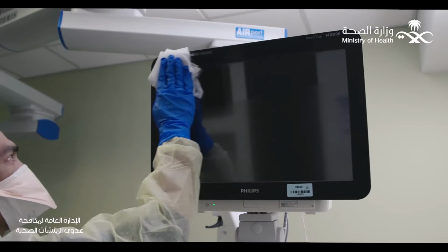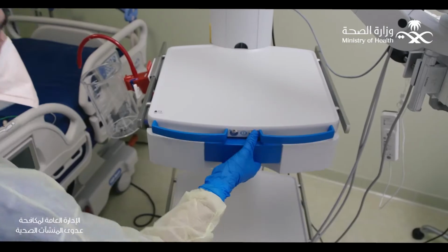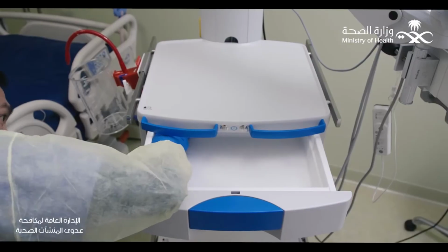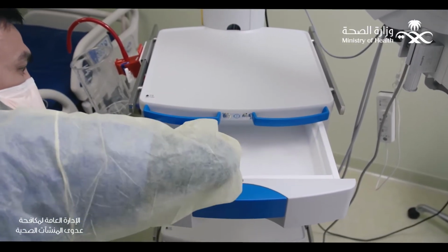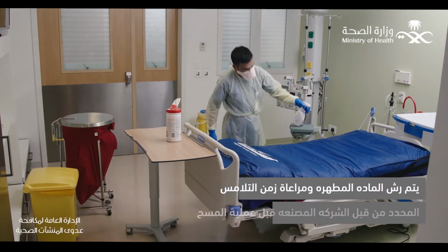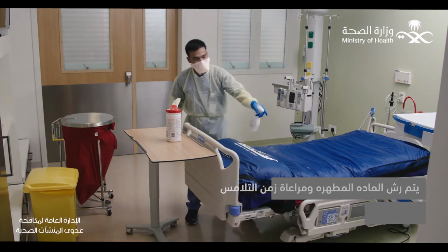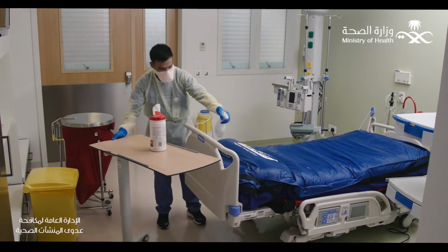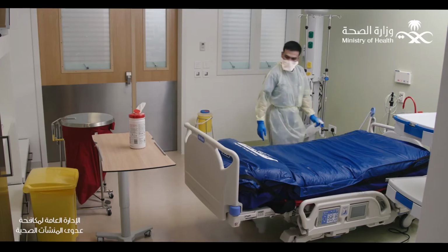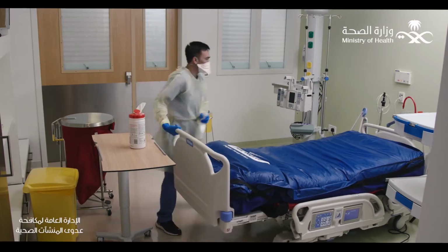Care should be taken to clean the screens of the vital signs monitor used with the patient in the correct way, so that every part of the screen is wiped and the drawers are wiped from the inside. And then move to the patient's bed. Then it is sprayed with the prepared spray, which contains a cleaning and disinfection liquid for disinfection of the patient's bed. It's carefully sprayed in every part of it.